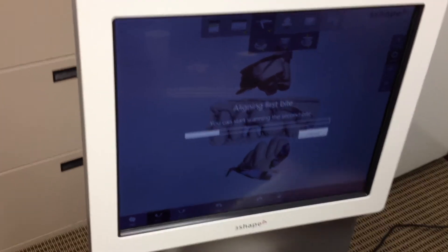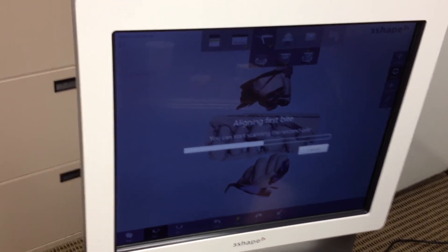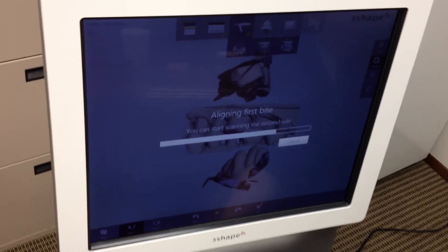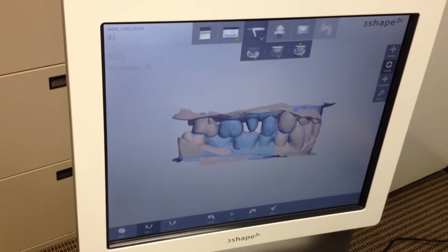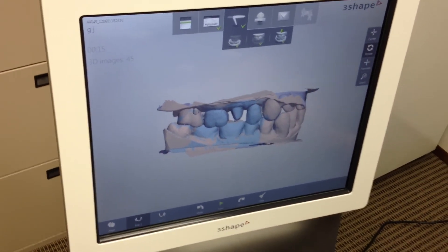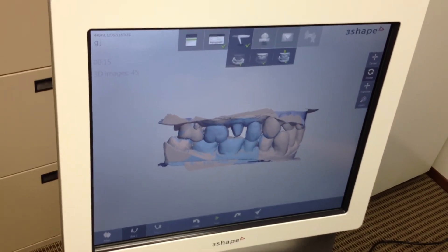And then automatically it aligns your bite. So now you send the file to the lab and they work with the model — they find the margin and then print the model. What they do is it goes to a program called Model Builder, which comes with 3Shape as long as you have the impression module. On there you create a base and basically create an articulated model.